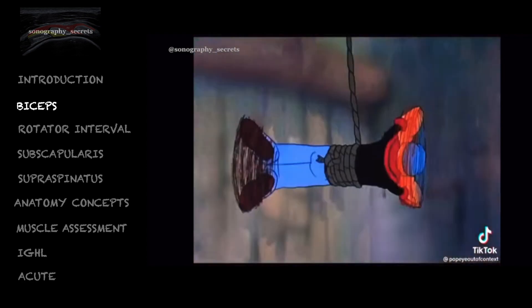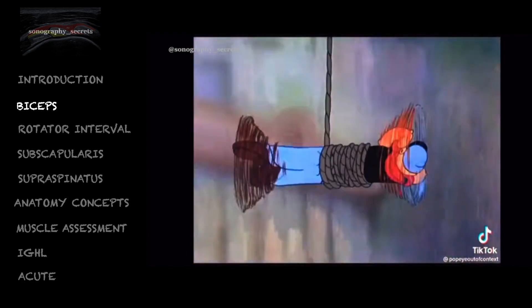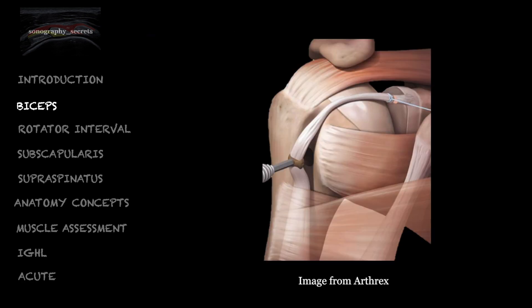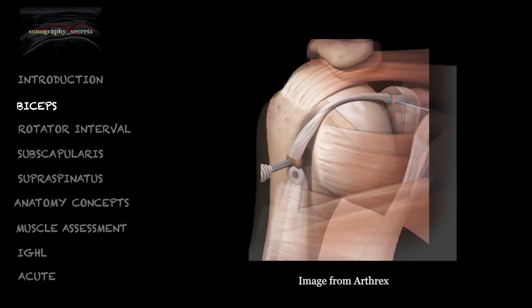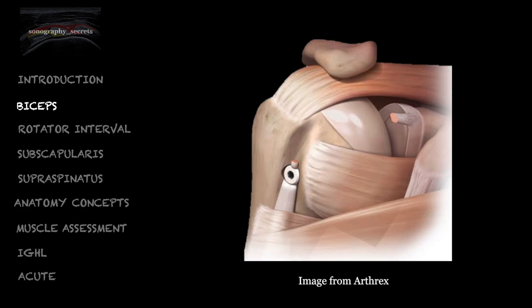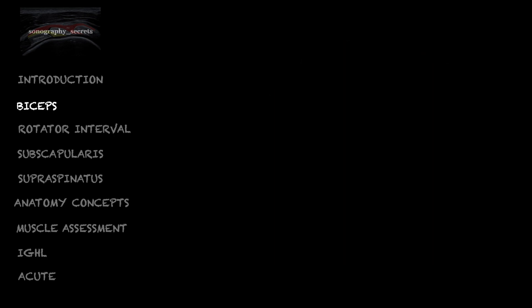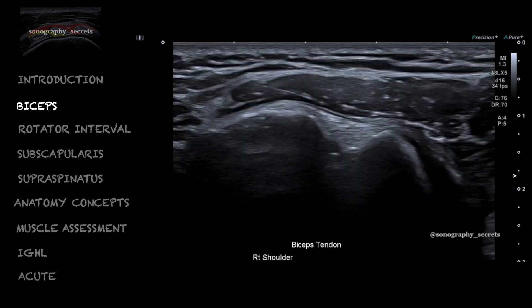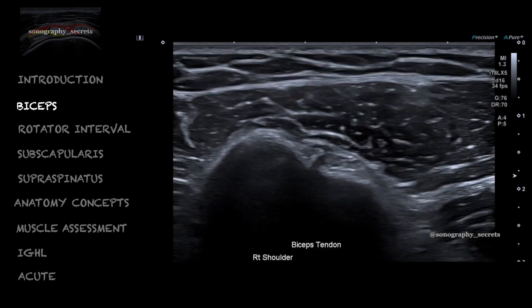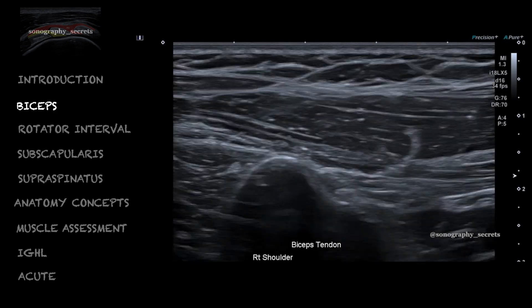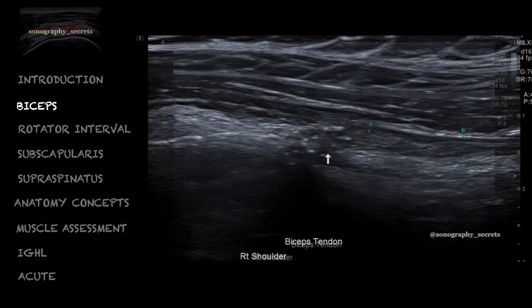In this case, it's a proximal MTJ tear of the long head. The post-operative patient always represents a challenge in ultrasound, as most patients cannot recall exactly what has been done. In these cases, you can bank on a biceps tenodesis — essentially, the proximal long head of the biceps is cut and reattached to the neck of the humerus.